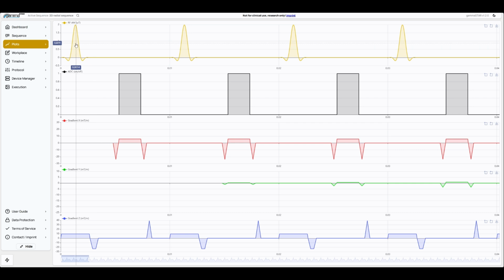And the reason is that we have the familiar excitation pulse with the accompanying slice selection gradient, additional rephasing of the slice selection gradient to make sure that we get the full signal from the magnetization back. And afterwards we have a prephasing on the x-axis, readout event and rephasing. And with succeeding repetitions, we see that we have our known additional encoding on the y-axis.